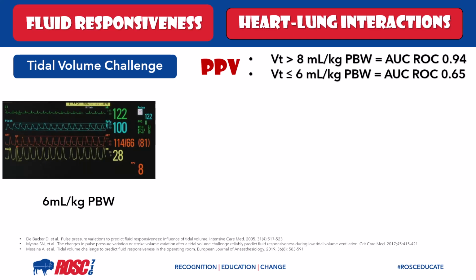Let me walk you through how this test works. Here you can see that our monitor is displaying pulse pressure variation. At 6 mLs per kilo of predicted body weight for a tidal volume, you can see that the pulse pressure variation is 8. This is less than 12%. So here it's saying your patient is not a fluid responder. This could possibly be a false negative due to the low tidal volume.